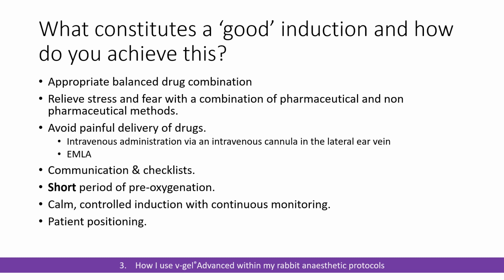Patient positioning is important. You need to think about that picture that we saw earlier. Think about supporting the chest. Sternal positioning is generally best in the early period of anaesthesia. That's what puts least stress on the chest. Try and avoid troughs which compress the shoulders into the chest. That's making it very, very hard for your patient to breathe.